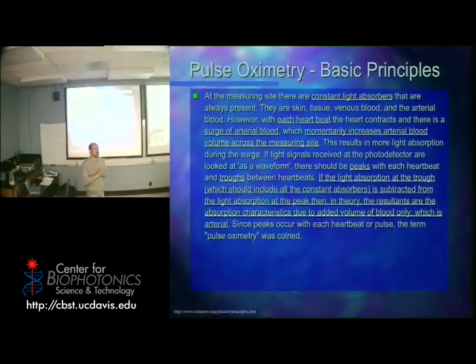The reason for that was because it was really hard to detect low oxygenation in patients on the operating table. The way they would detect it is the nurse or the doctor saying, oh my gosh, the patient's blue. This is a problem. The patient has lost color in their face and tissues. That can be too late because that usually means you're down somewhere in the low 90s, okay, or even below 90, and that can be a problem. So traditionally now, they have this machine that monitors it, and the moment they see something going down, they can immediately interject.